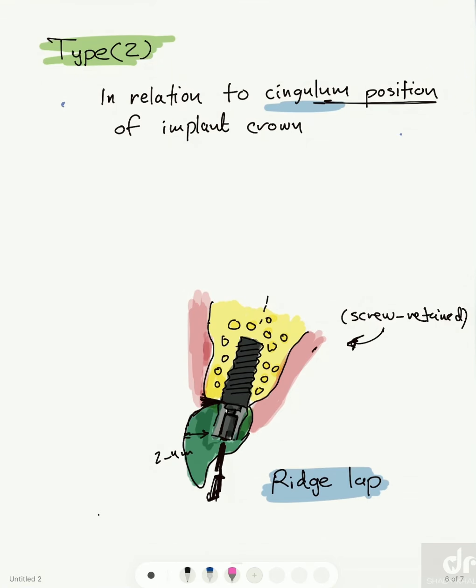If you remember in crown and bridge and fixed prosthodontics, we called it a ridge lap, that is, to extend the crown facially more. So it's logical to be in the cingulum, so the crown will be on top. Okay, when can we use this? We have indications. It will be in low width, if we don't have enough space width, I mean anteroposteriorly we don't have much width, so we can use this technique.